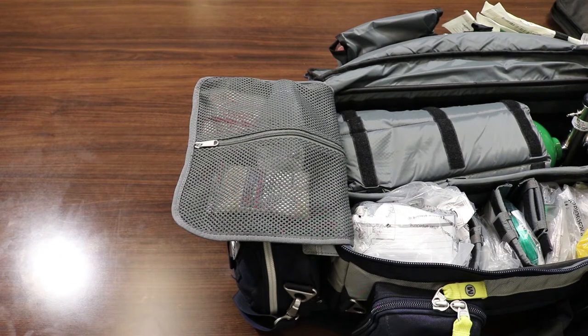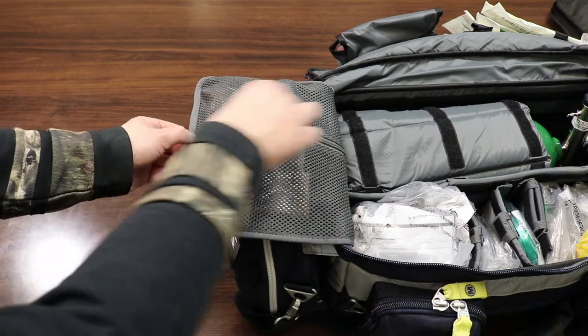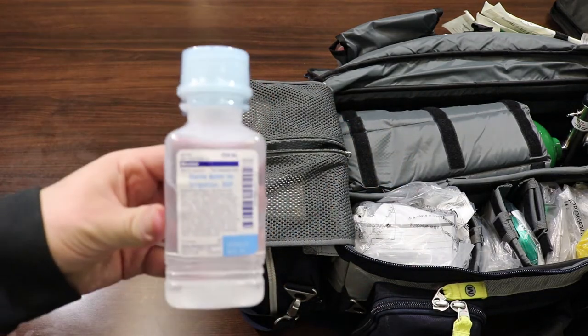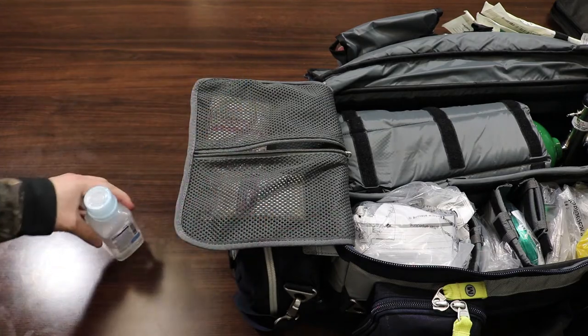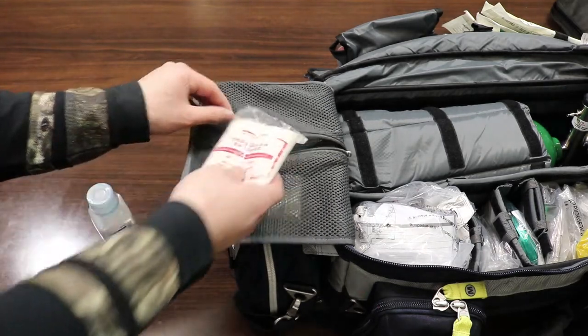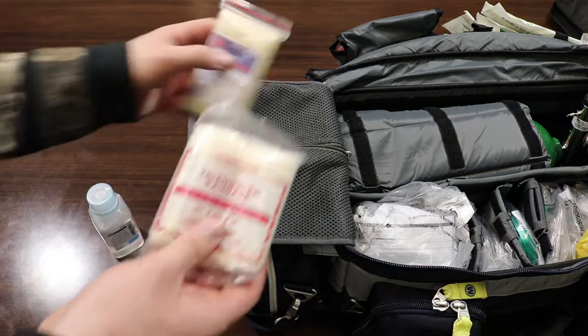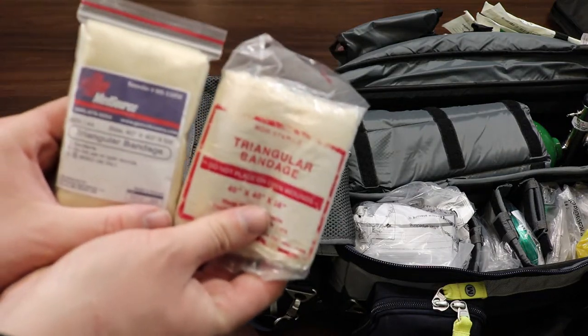In the main compartment on the left side flap there are a few different things. We have some sterile water as well as two different triangular bandages.